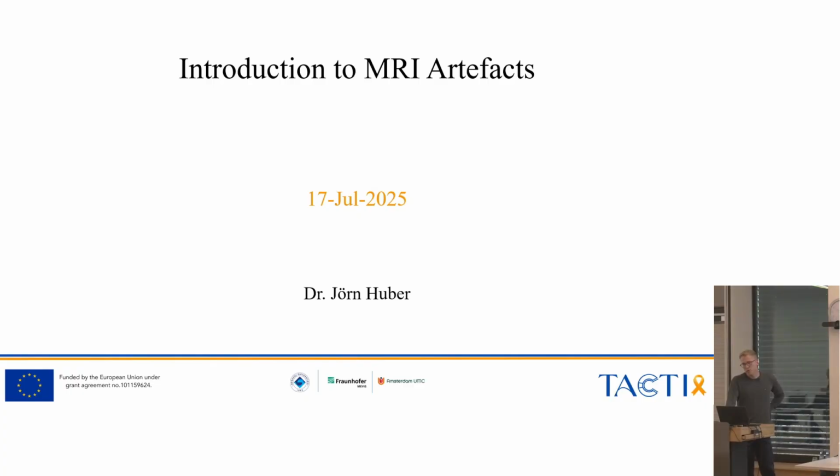Yesterday and today we already saw many different MRI techniques, for example the SPAM technique which Mareike introduced to us. We saw some T1 and T2 weighted imaging from Matthias' teaching tool yesterday. We also saw how to suppress specific signals from, for example, fluids or fat using inversion recovery sequences. And we also heard about arterial spin labeling.